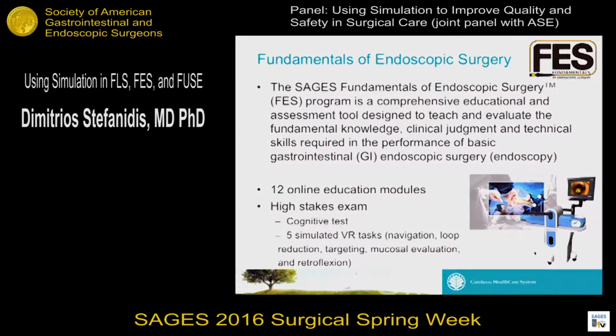This program consists of 12 online education modules, which are free, but it also has a high-stakes exam that includes a cognitive test as well as a simulator module. It's a virtual reality simulator, and you have to perform 5 tasks that relate to fundamental endoscopic skills like navigation, loop reduction, for example when you do colonoscopy, evaluation of mucosa, retroflexion, targeting, etc.